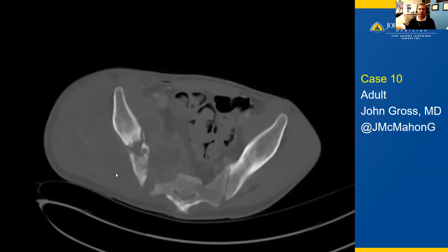Here we have the axial view. Again, we have a large destructive mass in the right pelvis that is destroying the iliac bone. It extends laterally and posteriorly as well as medially. But if you look very carefully, there are little foci of white matrix mineralization, which is a clue for us radiographically.